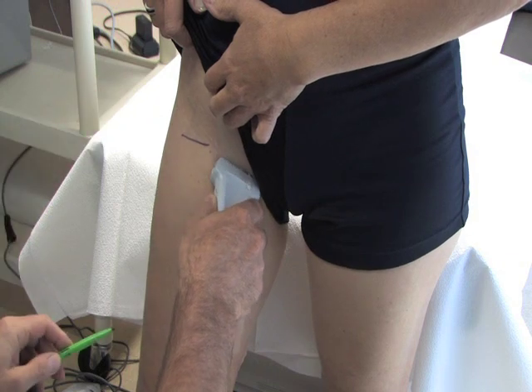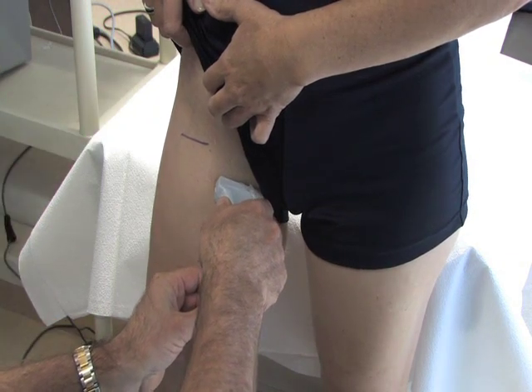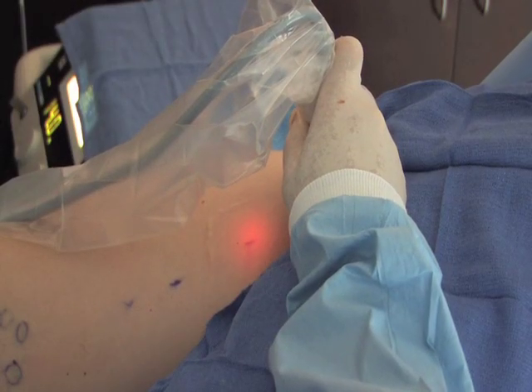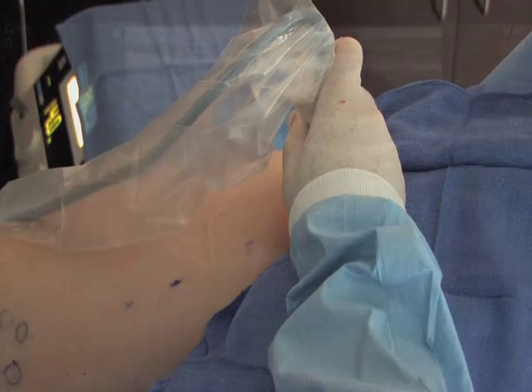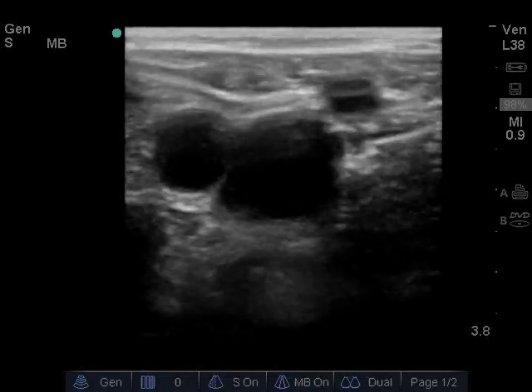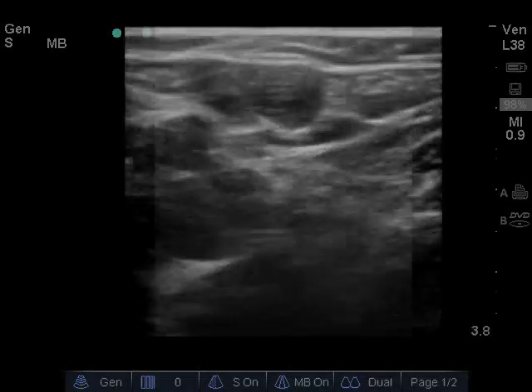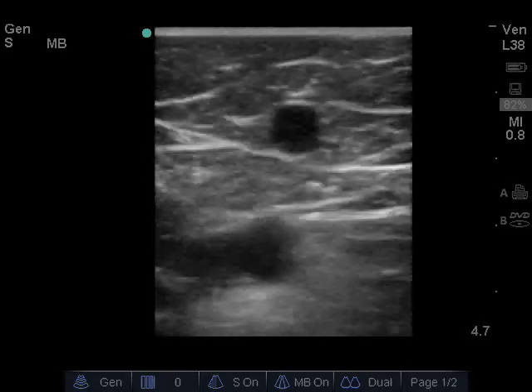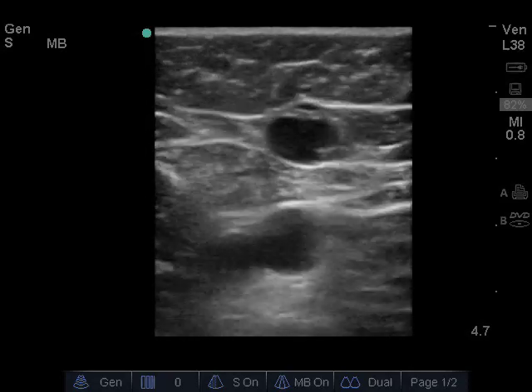Ultrasound is used both to assess patients' lower extremity superficial venous systems for valvular reflux and to guide endovenous laser therapy for varicose veins if reflux is identified. It is critical to ultrasonographically assess the entire length of the greater saphenous vein to prepare for the procedure and to identify potential barriers such as extreme tortuosity or discontinuity of the vein.